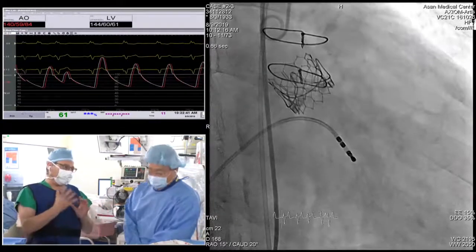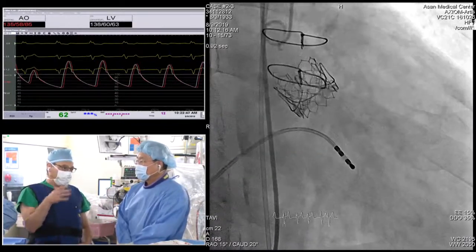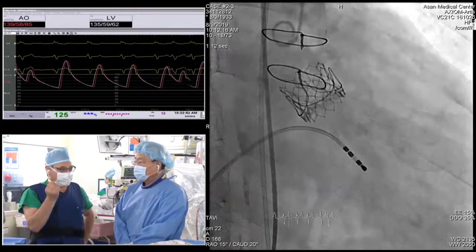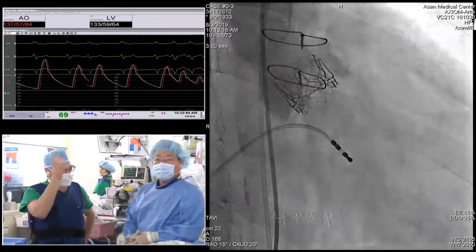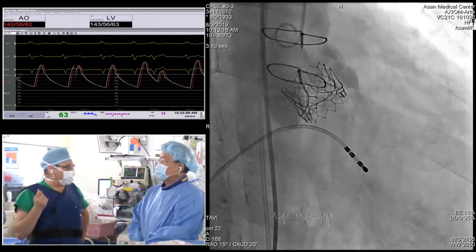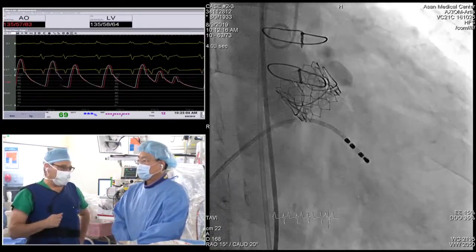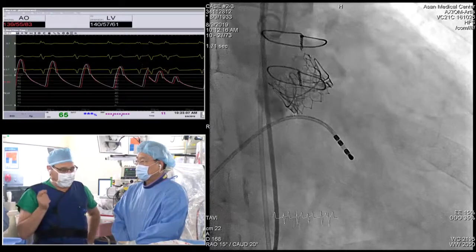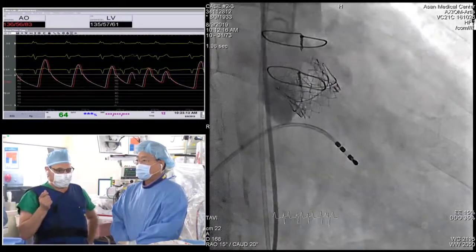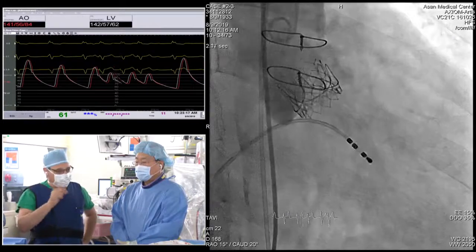Whether the self-expanding versus the balloon expandable, that's a little more debatable. Certainly for many years, we also believed it's easier to get a low gradient with a self-expanding valve. And if you use a self-expanding valve, supra-annular, you may obviate the need for some cases of fracturing. What we have found recently, and we published this last year or early this year, in one of the surgical journals, as our series has expanded, we've been able to look at it more carefully.